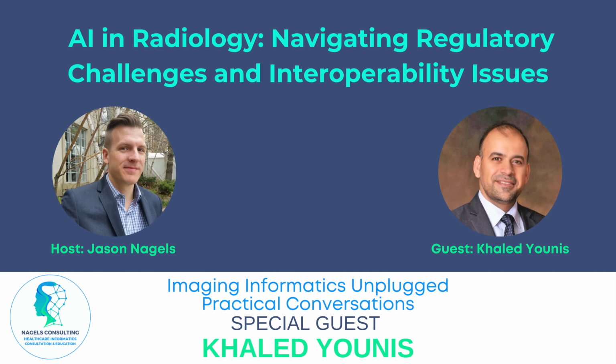But I believe in the power of real-time decision support. For example, the pneumothorax algorithm developed by GE helps find the patient that has pneumothorax on the spot, on device, before the patient goes back home. So this power is good.